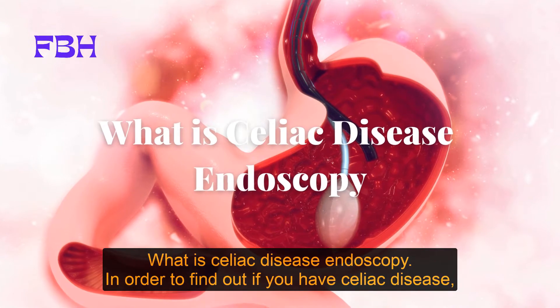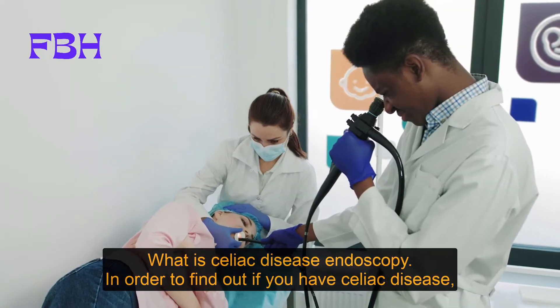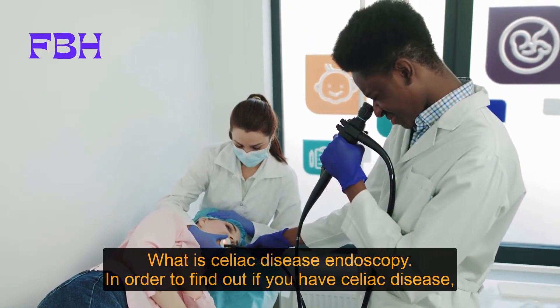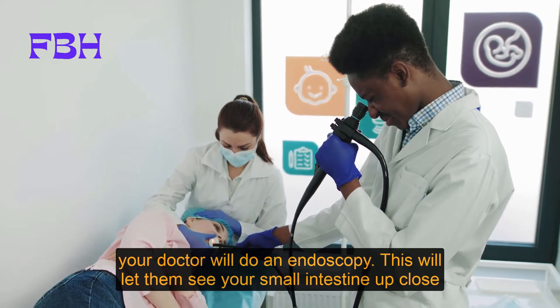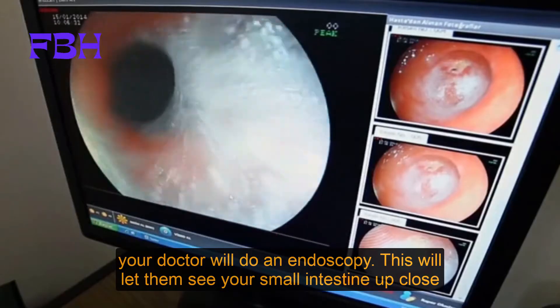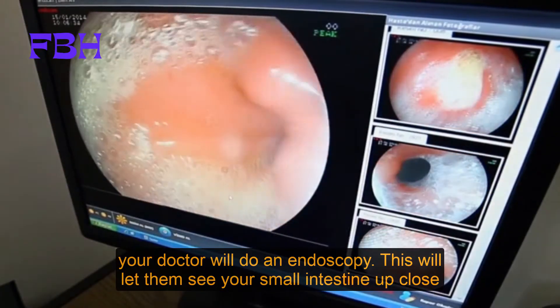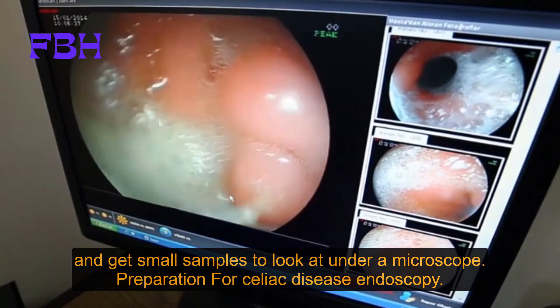What is celiac disease endoscopy? In order to find out if you have celiac disease, your doctor will do an endoscopy. This will let them see your small intestine up close and get small samples to look at under a microscope.